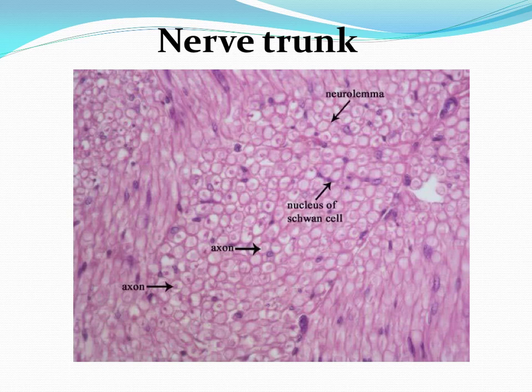In this picture you can diagnose that we have the nerve fiber like this, and in the center we have a faintly stained axon, and this area here should be the place of the myelin sheath, but as it dissolves during preparation of the section in alcohol, we have just the framework which is called neurokeratin.